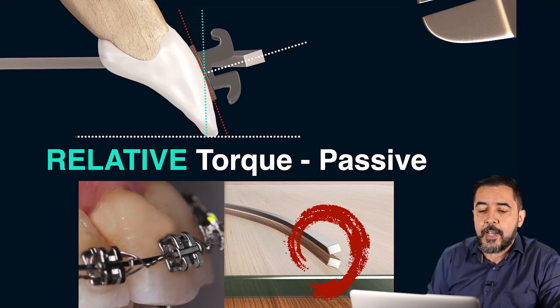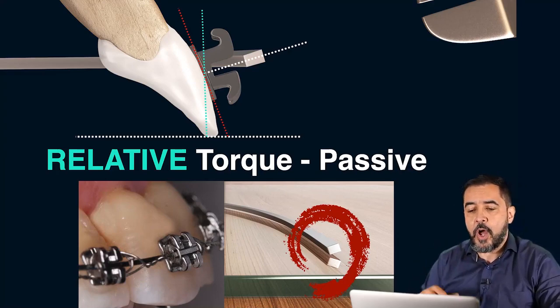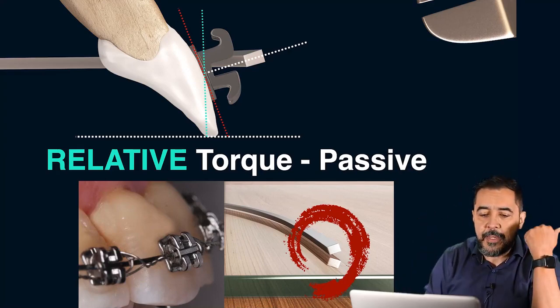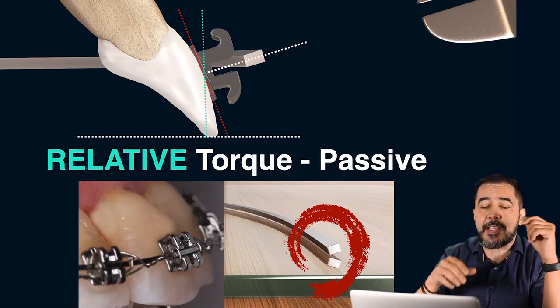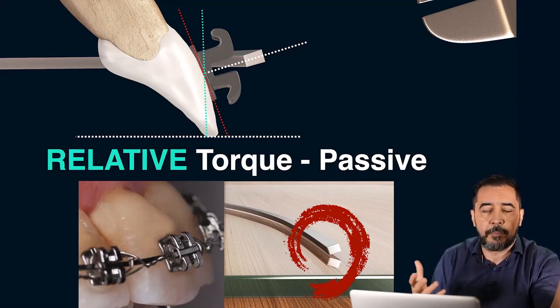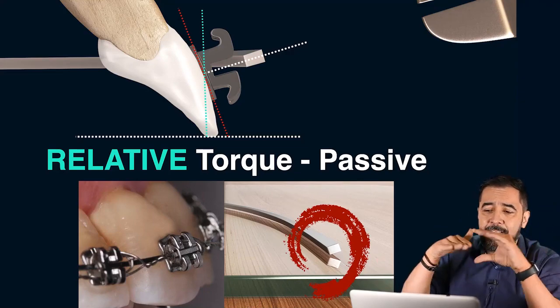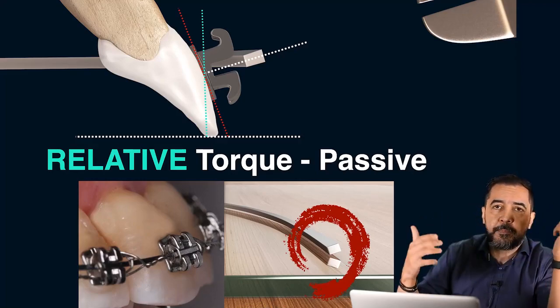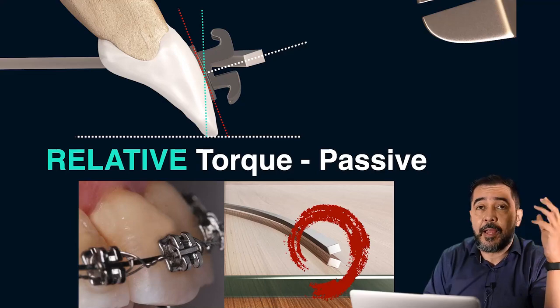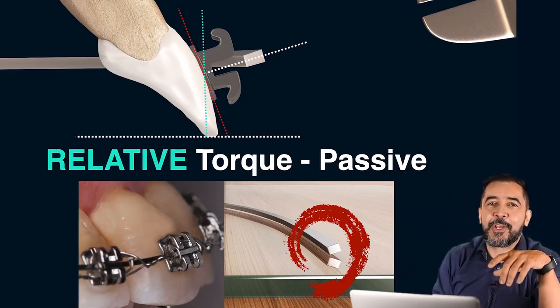We have here a situation that I saw in one of my courses. One of my students came to me with that situation. "Doc, please, Prof, come with me and see what's happening in my case. I'm trying to put the arch wire inside the bracket slot, and it is not going in because it has huge friction, and I'm not able to put it inside the slot." And that made me thrilled. Wow! Let me take a picture of that.